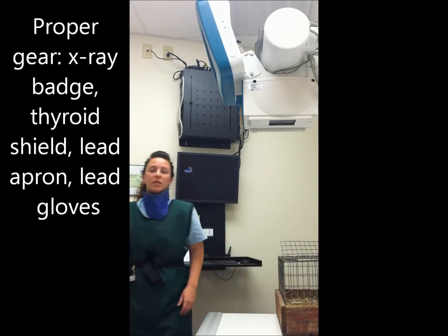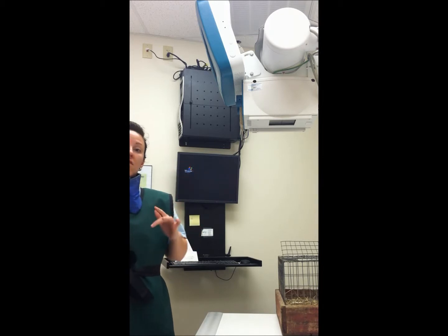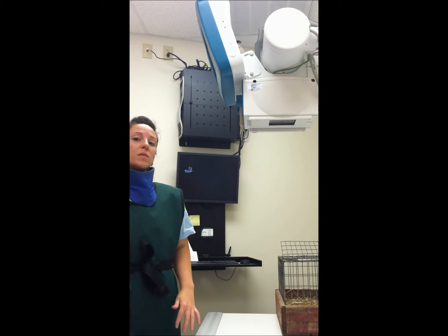Our bird that we use today is a dove. She was very disgruntled and did not want to be in the video for us. However, we did try and hold her down in the least stressful manner with a manual restraint. Chemical restraint would be the best option, however, it was not our option today. It is recommended to do anesthesia or some kind of light sedative, usually with a mask. This helps. So we would put that information into our x-ray machine. Again, the KVP will be a little lower, the MAS will be a little bit higher.